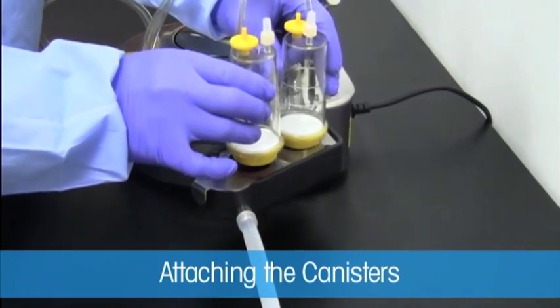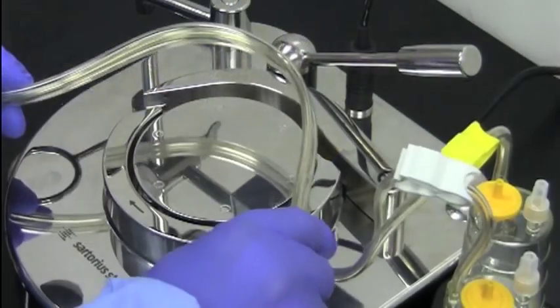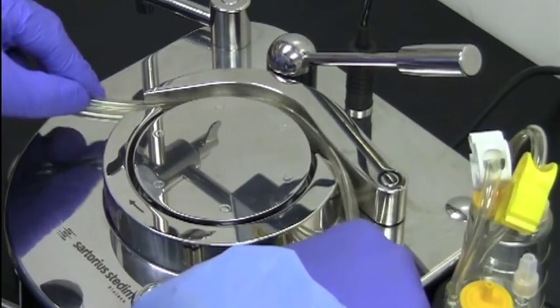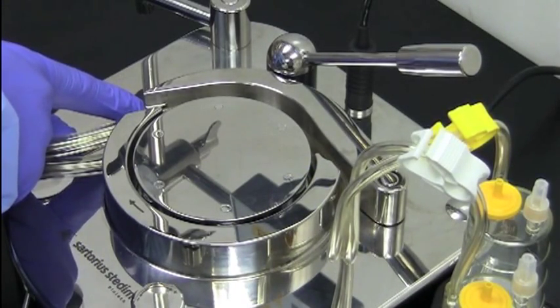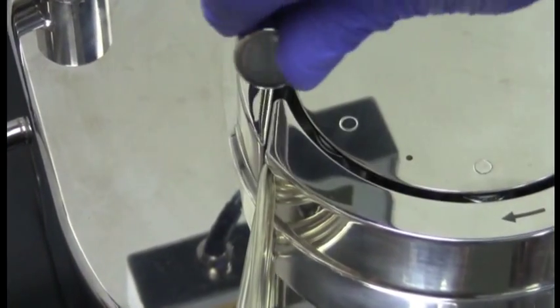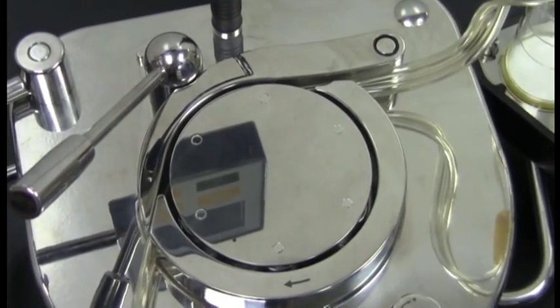Attach the Sterisart canisters to the dual draining container. Place the Tigon tubing between the bow and the peristaltic pump head, being careful to separate the tubing above and below the threading point rail on the bow. Turn the lever to clamp the bow closed. This keeps the connection between the tubing and the peristaltic pump head taut.